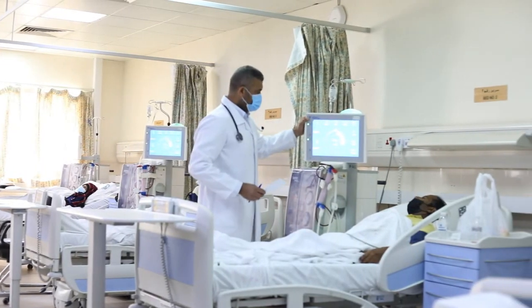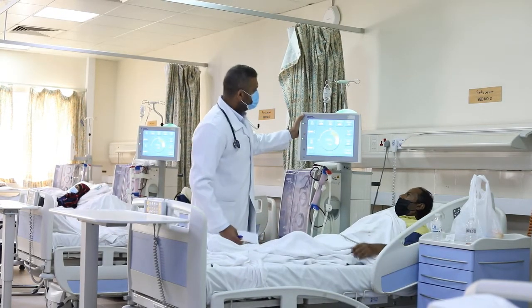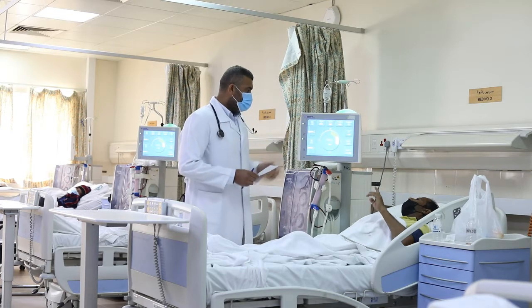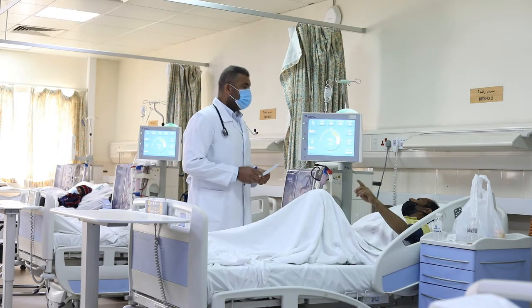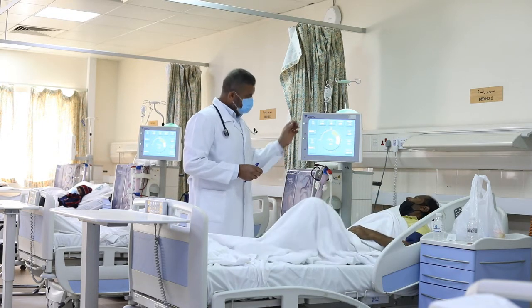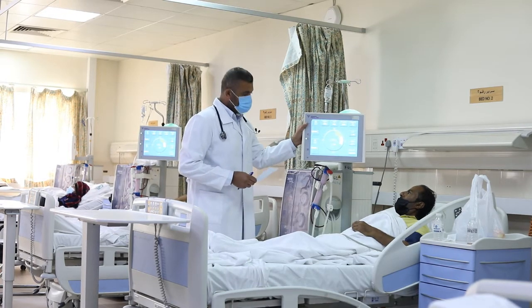really our best target. So we are monitoring Kt/V on a monthly basis for all patients based on blood sampling, and by a special equation we can assess this, and on follow-up we can improve the dialysis prescription to get a better Kt/V and a better dialysis quality. Moreover, now, due to the advances of the hemodialysis machines, we can even measure the Kt/V every session, not once monthly as before, by what's called online clearance monitoring.